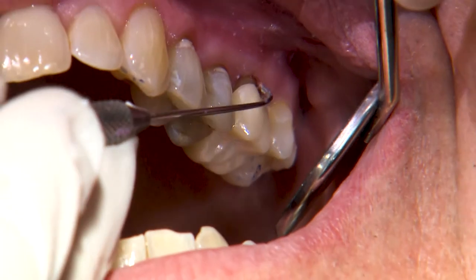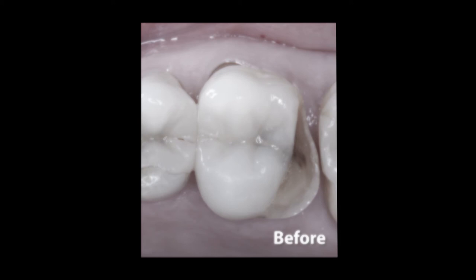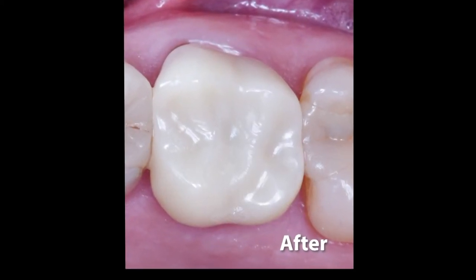After the crown is cemented, it's always a good idea to check the occlusal contacts again. And there you have it — zero compromise for an immediate Bruxer Crown using the Glidewell in-office solution.